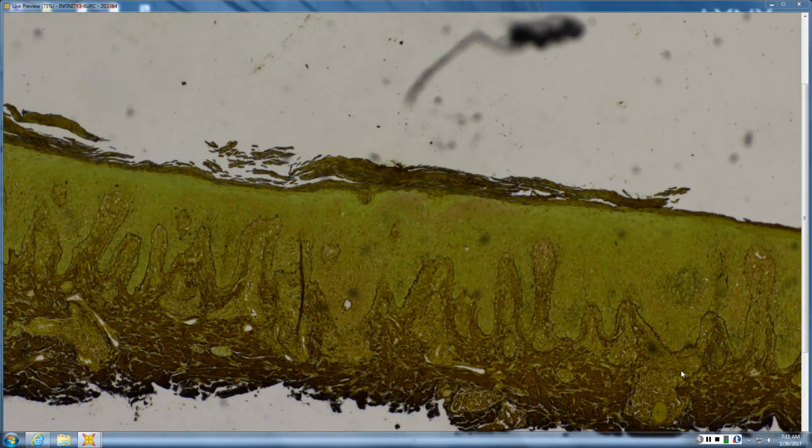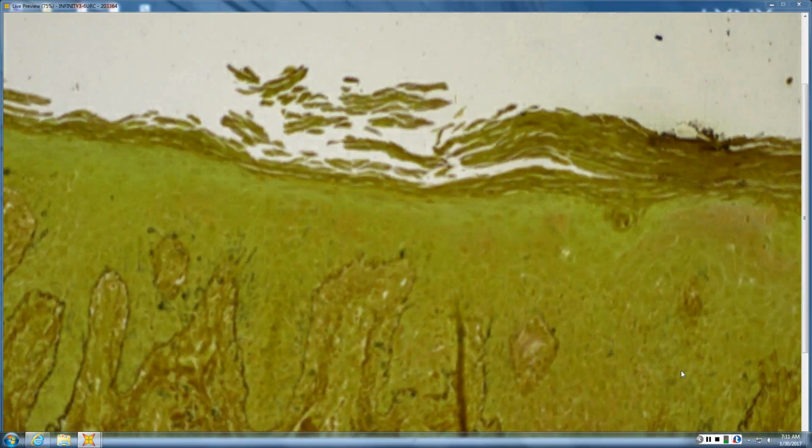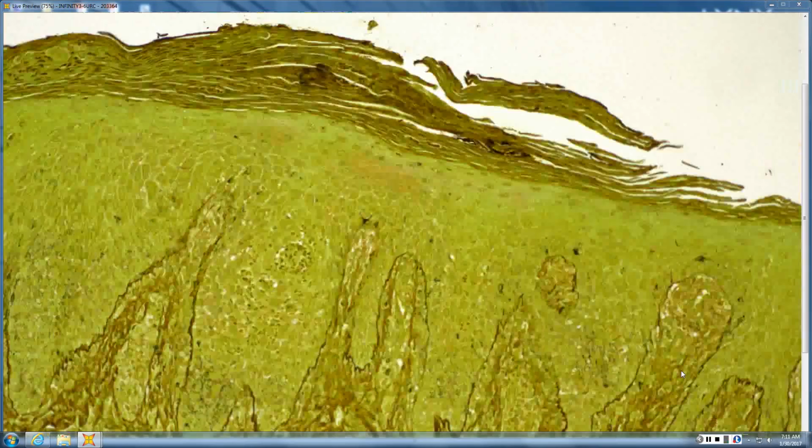very tiny little squiggly spirochetes. And so nowadays we like to really use the treponemal stain, more of an antibody stain, which is much easier to read. But it, of course, isn't perfect either, and sometimes it can be negative.